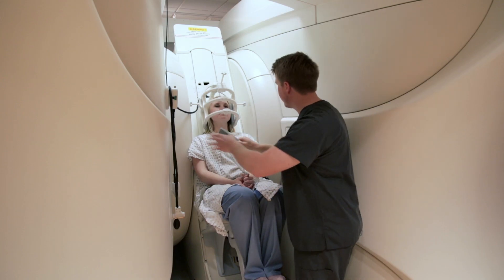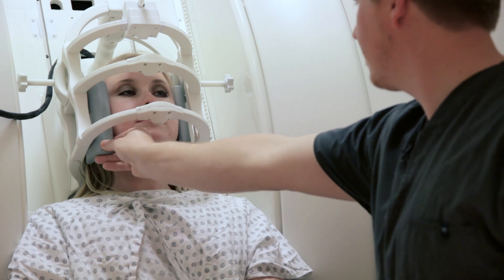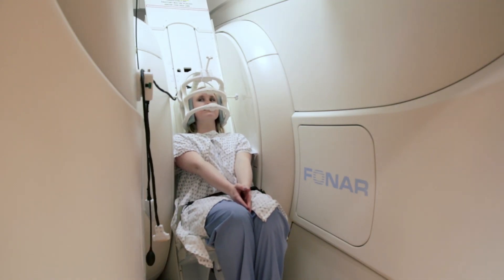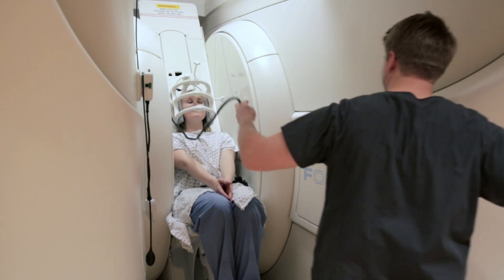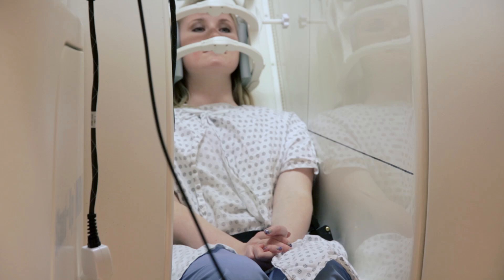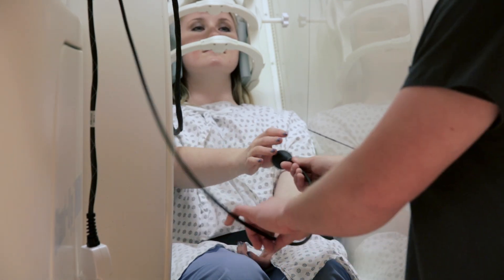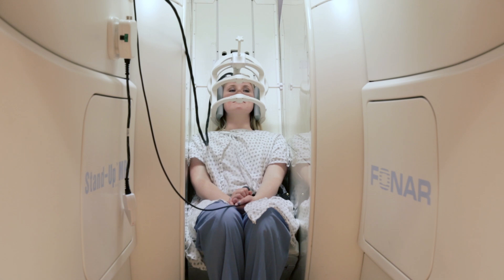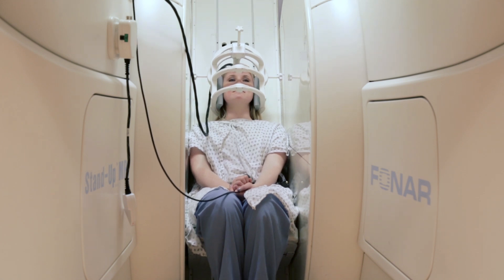We'll put some sponges around the head coil to make sure that their head feels stable but not restricted. We just want to make sure that the patient doesn't move during the scan, because we don't want them to be in there any longer than they have to be. We'll give the patient a squeeze ball every time they go in for an MRI, so they can communicate with us if they're having any issues while the scan is going on.